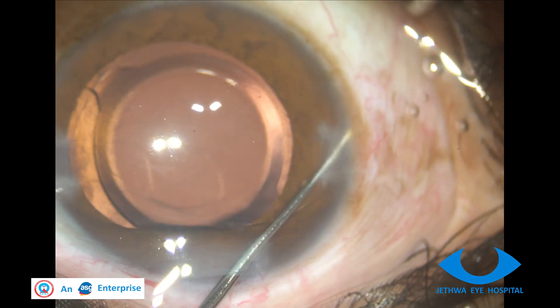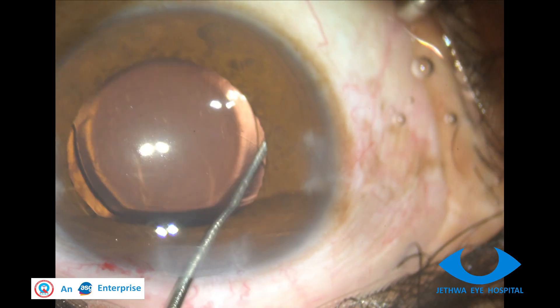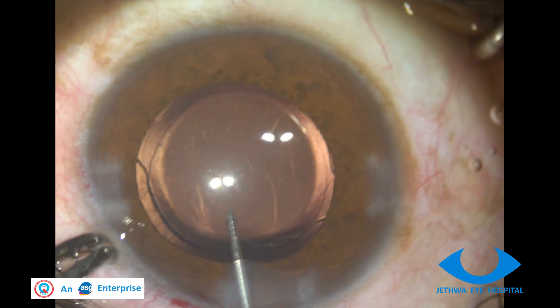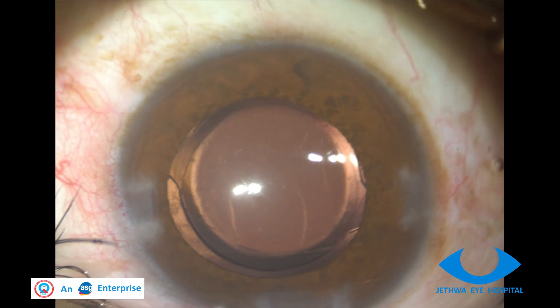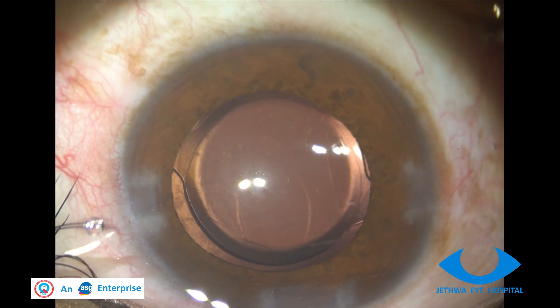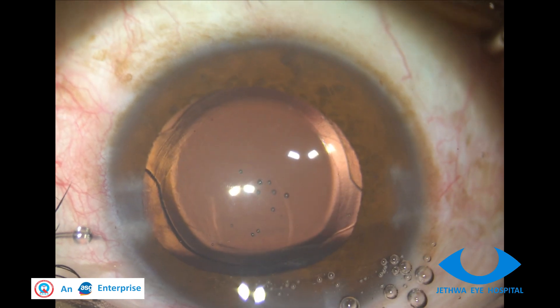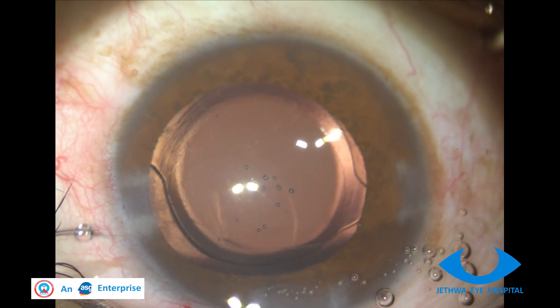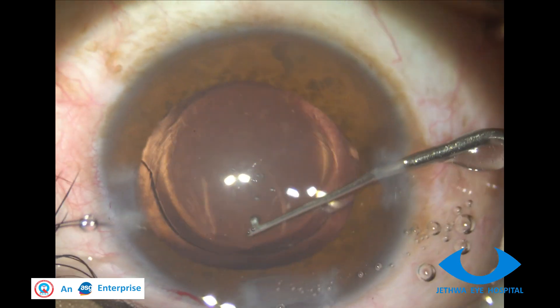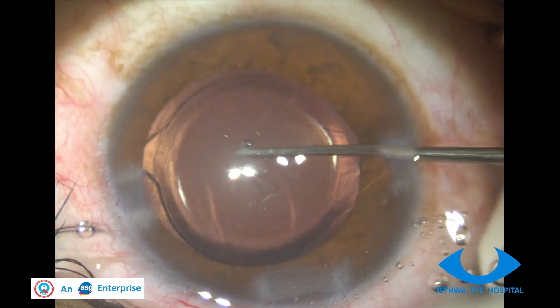Once the chamber is deep enough, flex the loop and put it in the back. Now let me confirm that the whole IOL is in the back — and yes, the optic is also confirmed in the back.